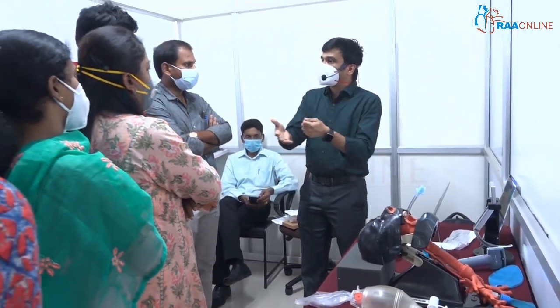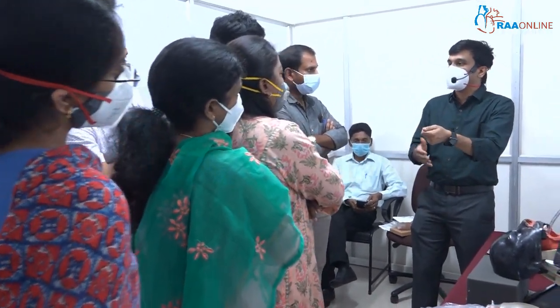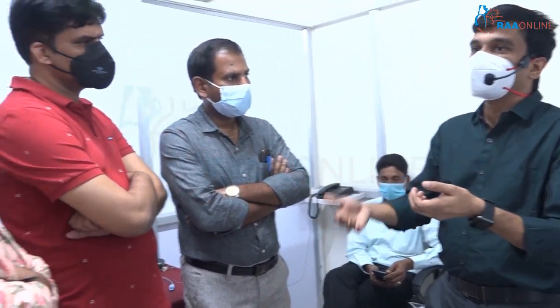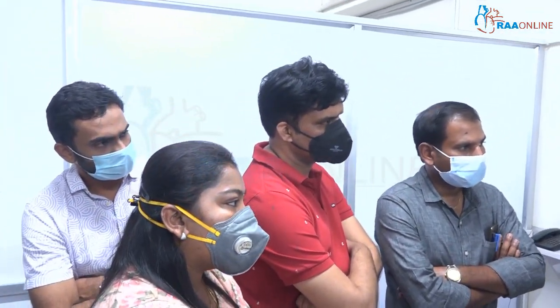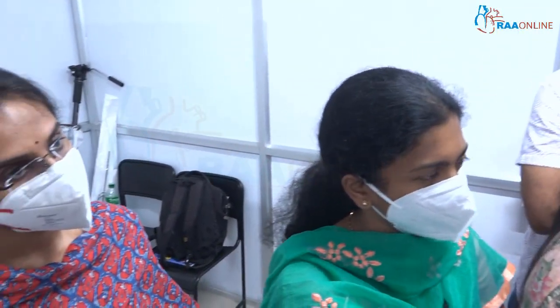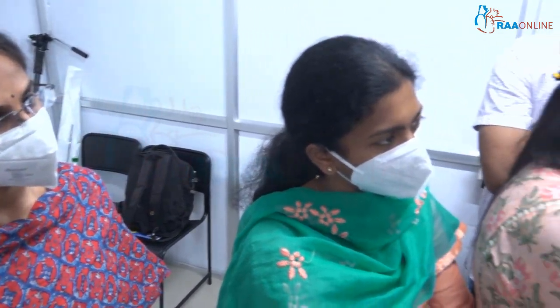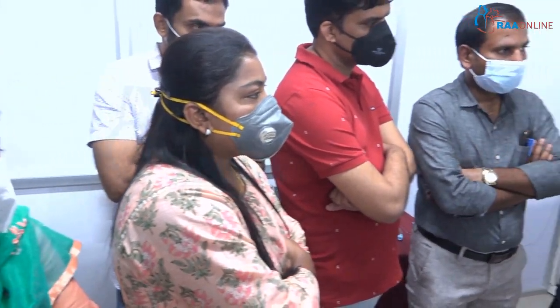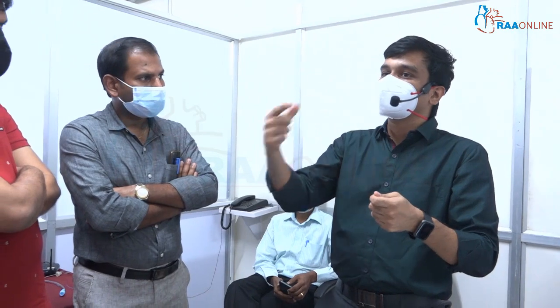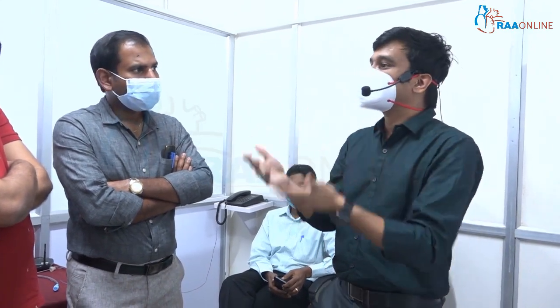When doing a laryngoscopy, I usually report what I see as a Cormack-Lehane grade — 2a, 3a, etc. But my assessment could be wrong. However, when there is an image on the screen, everyone in the room knows what needs to be done. For example, if someone needs OELM or external laryngeal manipulation, team members can act without being asked, because they can all see what is required.